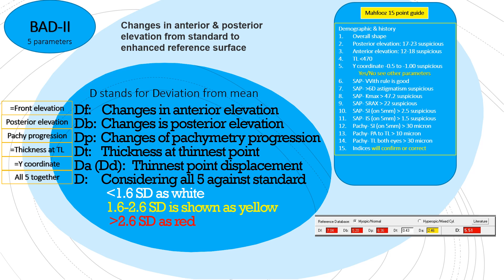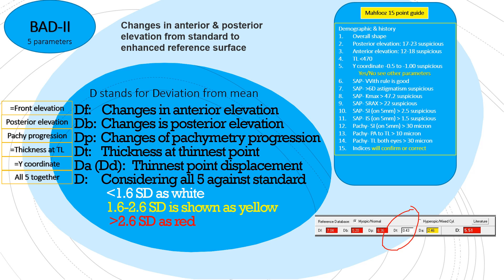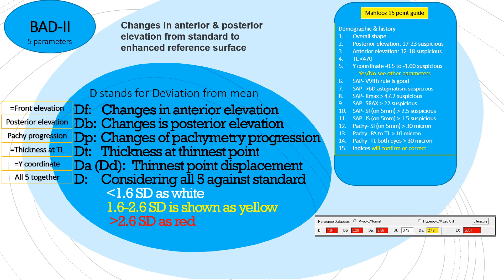In this example, DF (front elevation), DB (back elevation), and DP (pachymetric progression) are all in red — highly suggestive of keratoconus. DT, which is the thinnest location, is in white, meaning the cornea is not thin. DA — the displacement of the thinnest location — is almost normal. But the total D is in red, so overall this cornea is most probably abnormal.